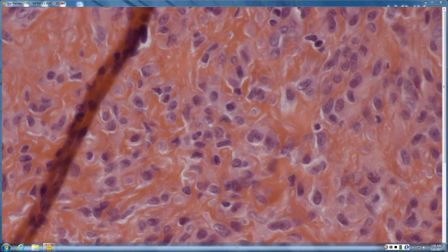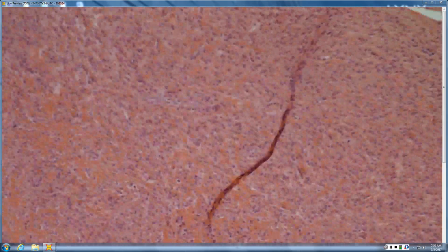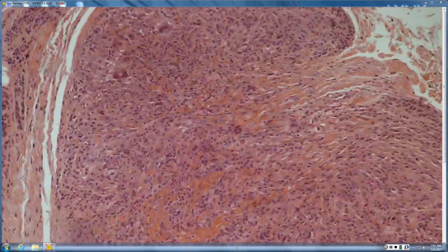So if it's collagen, this is a lump of cells producing collagen, and they're all uniform and gray, kind of epithelioid. Epithelioid histiocytoma is one, tends to be kind of superficial.